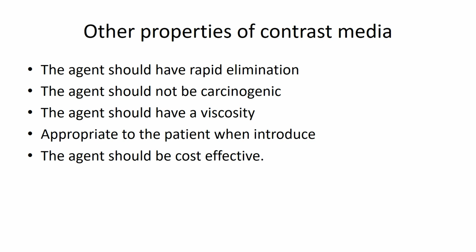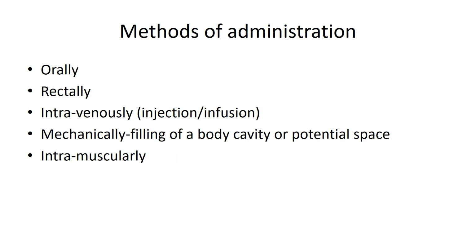And it should be appropriate to the patient when introduced into the biological system. In spite of all these properties, one major important thing is that it should be cost effective, so that the contrast agent is affordable by the people.